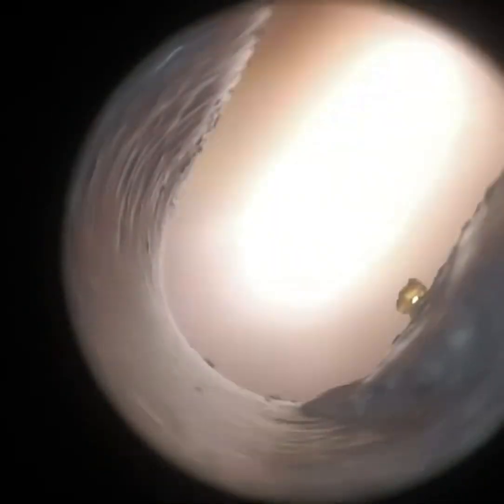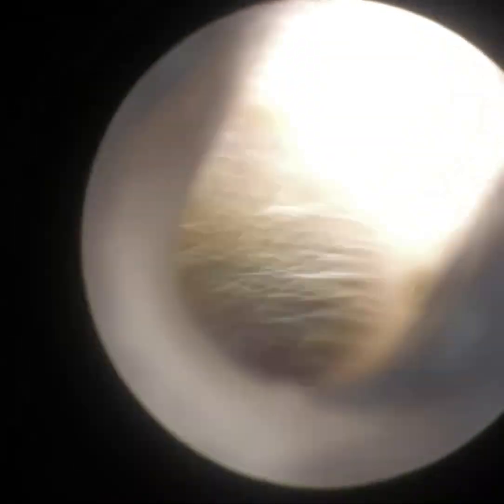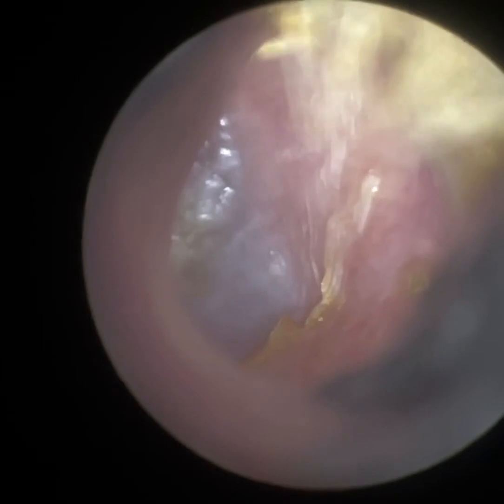You can see I'm just moving it about there. This is a 3.5mm speculum — for me it would be fine with all cases, truth be told. But a 4.25mm I think is going to be the most commonly used. We've got the full range of sizes, and some people prefer larger sizes.